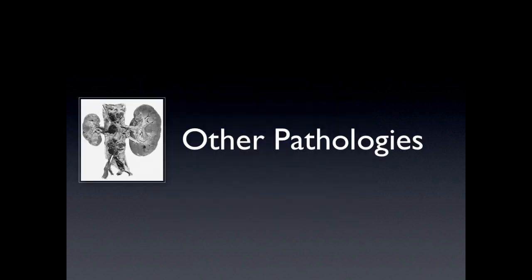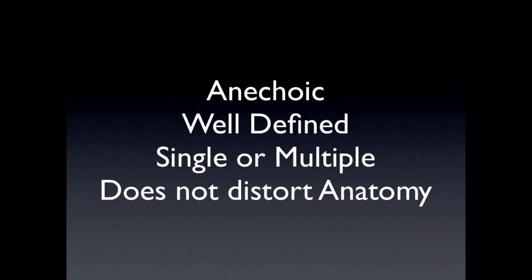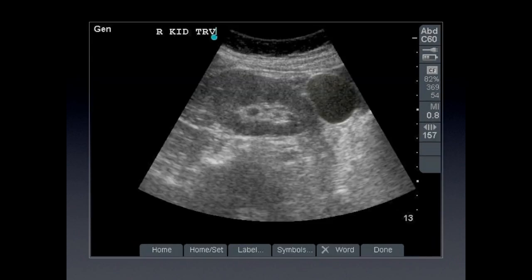Let's talk about some other pathologies visualized on ultrasound. Renal cysts are normally thought of as benign. They're anechoic, well-defined, single or sometimes multiple — like in the cases of polycystic kidney disease — and they usually do not distort the anatomy. Here you can see the liver with the kidney and the cyst as a well-circumscribed area. The same situation is shown on the right side — you have that cyst.